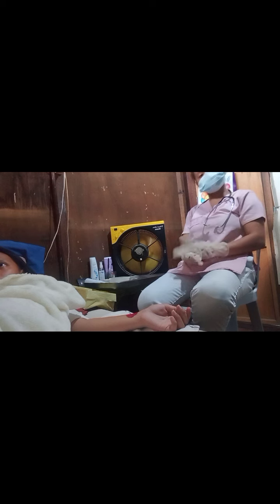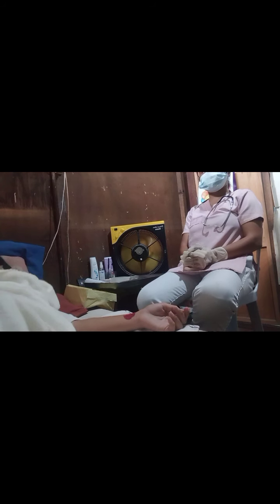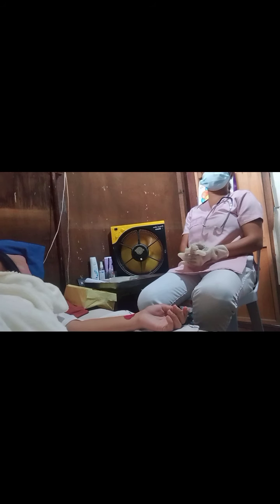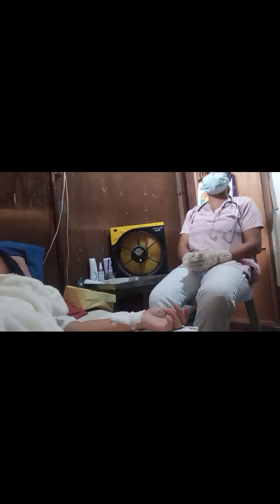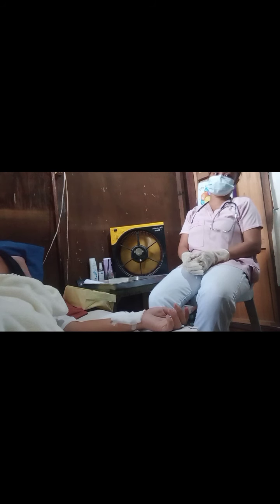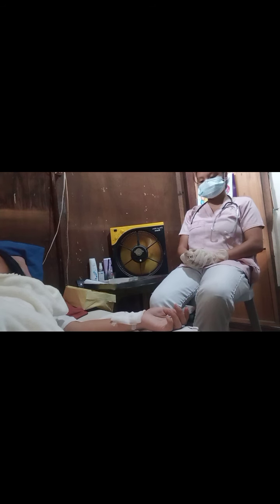Instead, gently loosen the dressing and warn the patient of potential discomfort. After that, I'm going to examine the amount, type, and appearance of the drainage on the dressing as well as the appearance of the patient's wound.